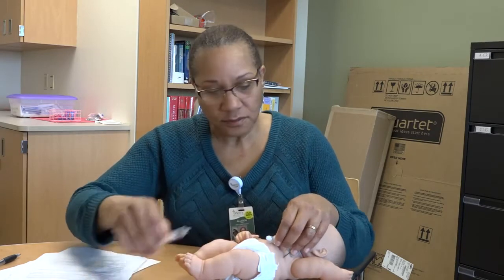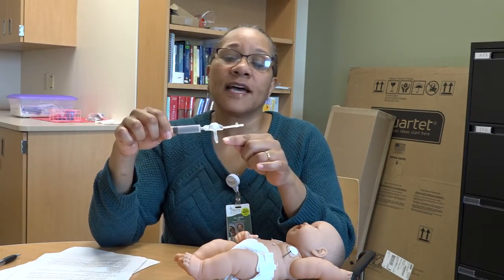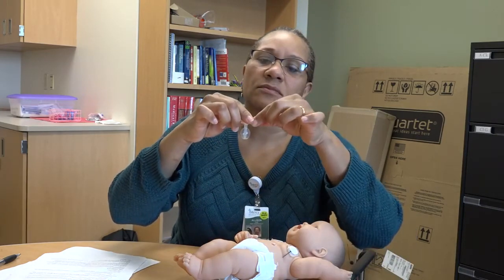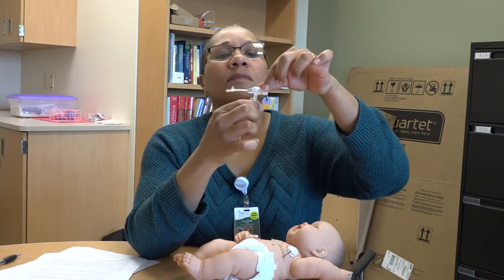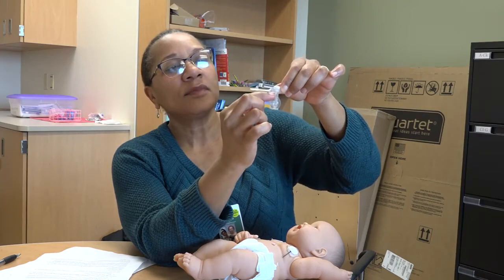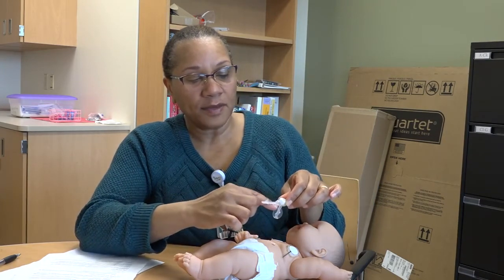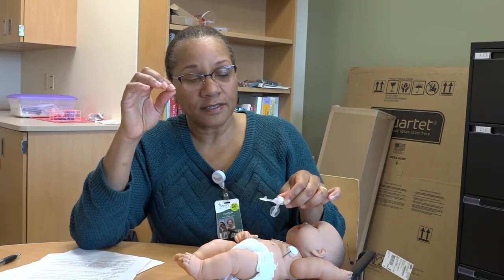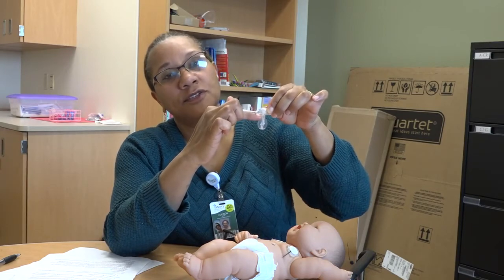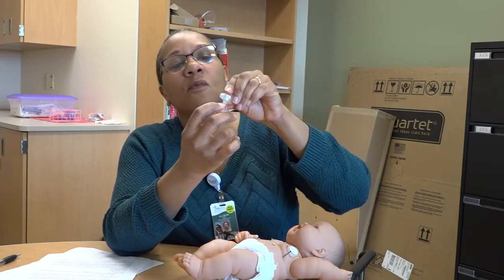So the appropriate fit would be about 3 millimeters in length that you're able to actually visualize. So I'm going to blow this back up. This is the bottom of the G-tube, and we want the bottom of the G-tube to have about 3 millimeters of space between the bottom and the top of the skin. If you think about the size of a quarter, and being able to slip a quarter in between your baby's skin and the bottom of this tube, that's about the amount of space that you want to have. You should be able to see a little bit of this white line.